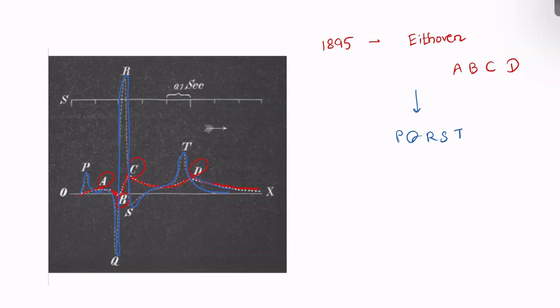At the time, he thought that O is like the O we use for nil, zero, and is something innate. And so he didn't like O, and that's why he used the letters after O, starting from P. He excluded NO from the list, and so starting from P, he named them PQRST. It is one of the concepts.